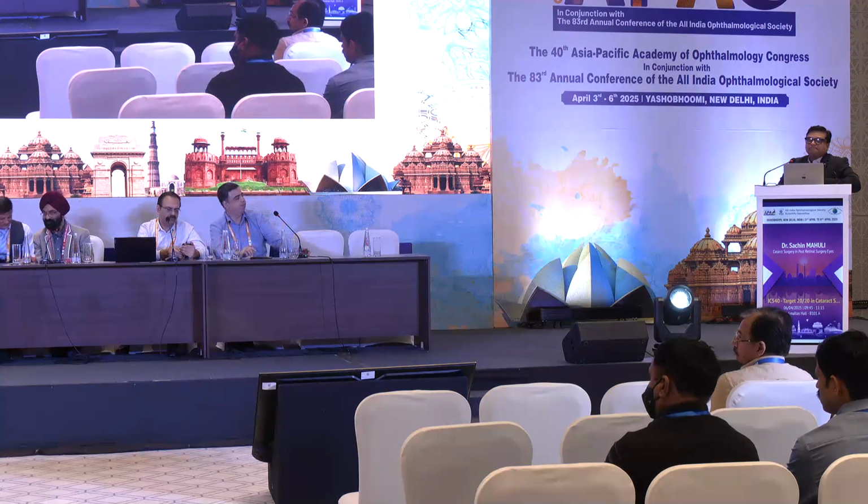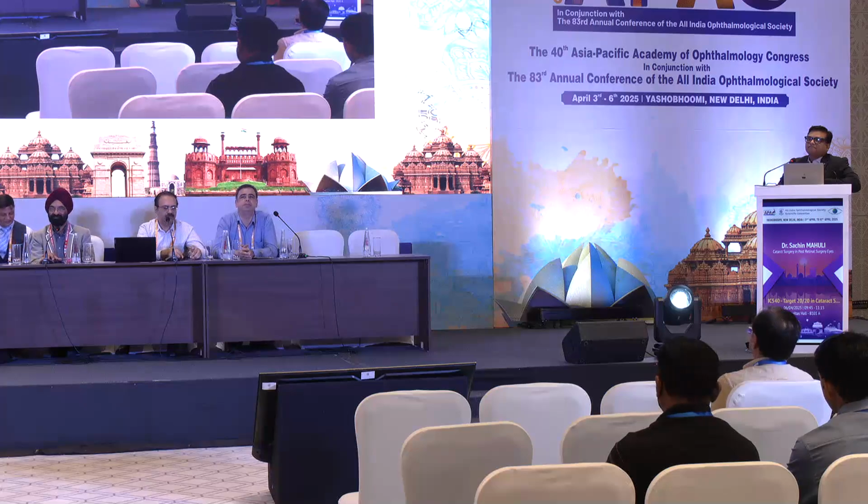And do you give anti-VEGF with the cataract surgery, or do you plan it 1 week before cataract surgery? You can do it with the cataract surgery itself based on the indication you are talking about. If it is a diabetic macular edema, you can do it on the table as well. We don't have to do it 1 week prior, but it is always advisable to do it at least 2 weeks prior, because you have optimal macular edema reduction, and the anti-VEGF stays in the eye till the post-op recovery.